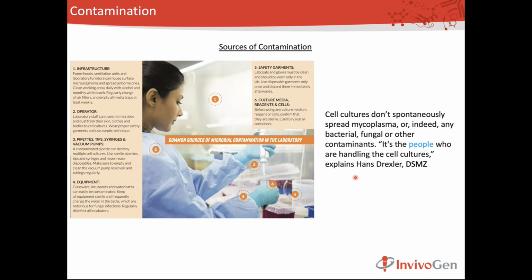Cell cultures don't spread mycoplasma, bacteria, fungi, or other contaminants. It's actually the people who are handling the cell cultures. So from him, the major source is the operator. We have to wear gloves, we have to wear protective clothing, and most importantly, don't talk when you're doing cell culture.